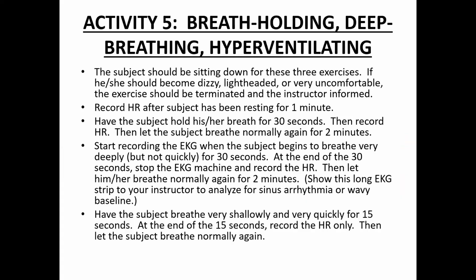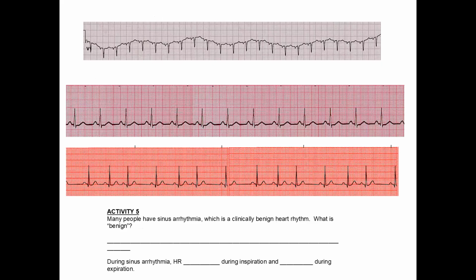And we could do breathing. You could do deep breathing and holding your breath, and you can see what happens to the heart rate when you hold your breath and when you breathe shallow, like hyperventilating. Deep breathing is not fast breathing. It's breathing in, inhaling and exhaling deeply. Not completely forced, but deep and slow. So again, we'd follow these instructions, go through it all, and then take a look and see what the difference is.